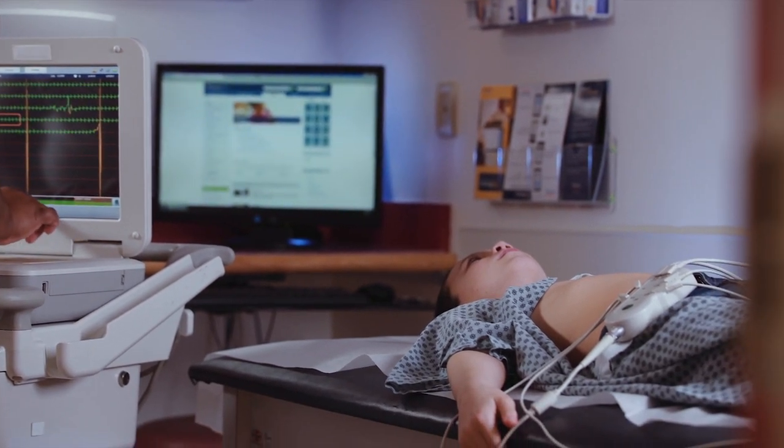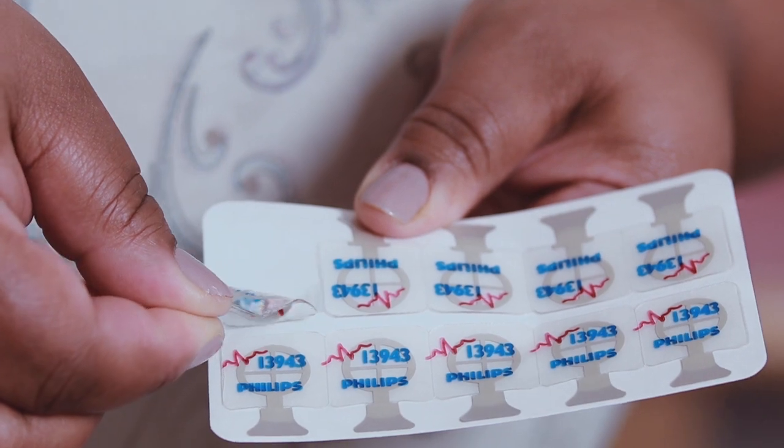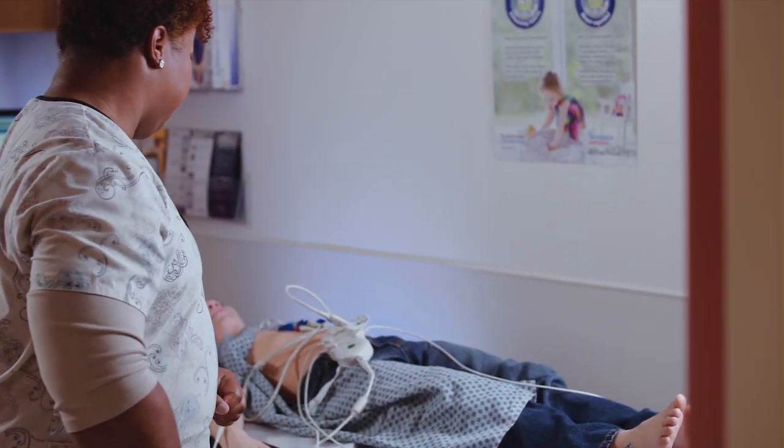Here's what happens. Your skin will be cleaned with an alcohol wipe. Little stickers are placed on your arms, legs, and chest. Then, wires are clipped onto each sticker. This doesn't hurt.